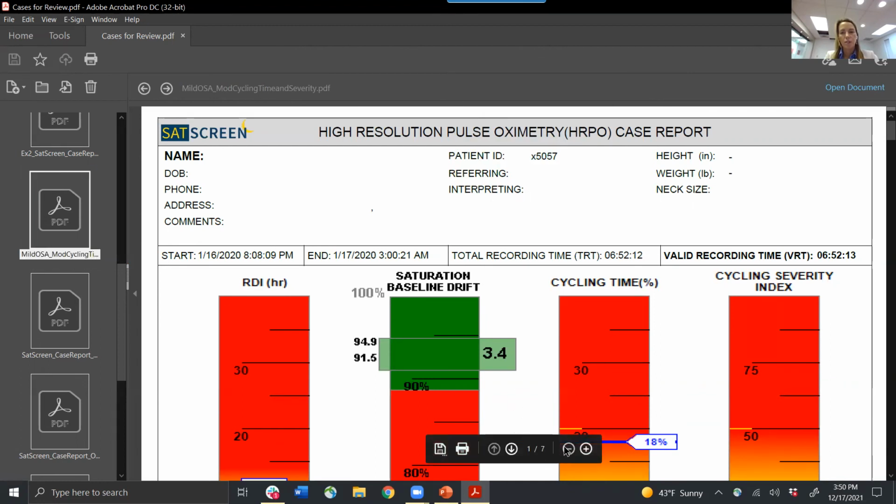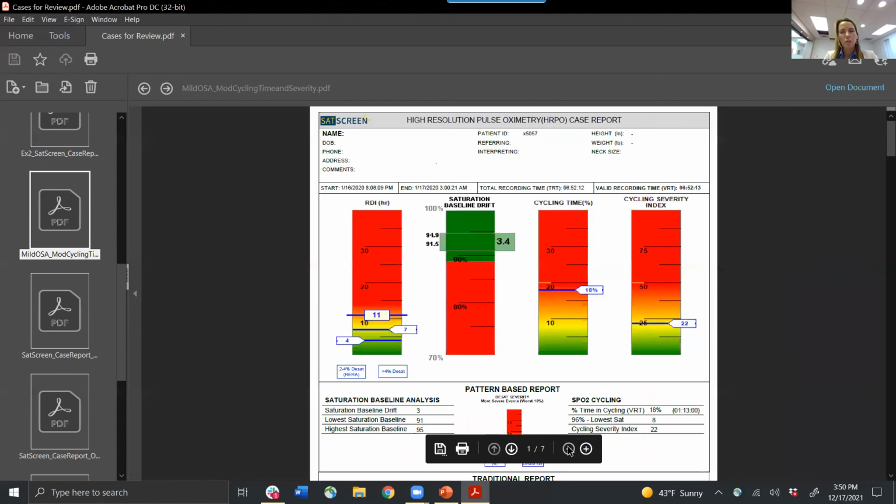In other situations, usually with that, I would recommend taking a baseline the first night just to be able to compare apples to apples, and then testing at 1 setting, 2 settings, 3 settings, setting 4, and finding that sweet point, then slowly working the patient into being able to tolerate that on a normal night. Again, sometimes patients don't sleep very well in those situations just because you are moving the jaw forward further and faster than would be normal.